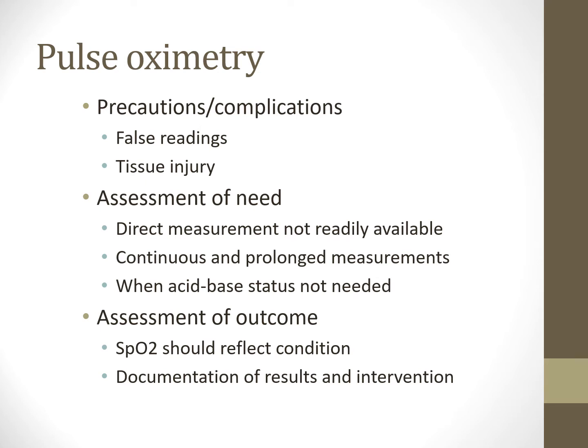Do they look like what the monitor says is going on, right? So something weird's going on. Look at the patient first, then work your way back, right? So false reading can also in theory cause tissue injury.